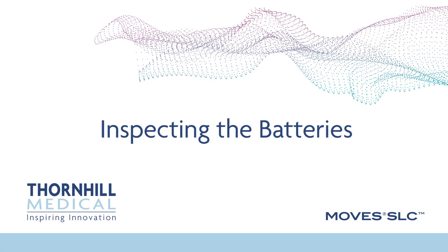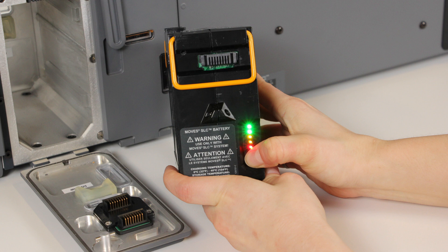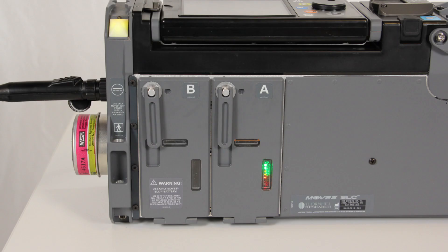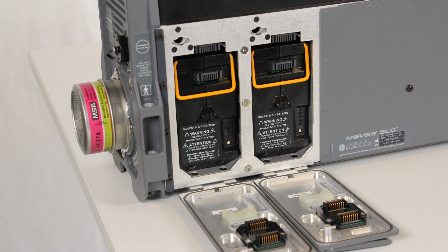Inspecting the batteries. On the front of each battery, just beneath the handle, there is a battery condition indicator. Pressing the button on the battery condition indicator shows the status of each battery. As the battery power decreases, the illuminated LEDs extinguish from green, meaning a high level of charge, through yellow, meaning a medium level of charge, to red, meaning the battery is exhausted. The power supply charger should charge both batteries to 100% in 2–2.5 hours while the system is running with a typical load. Note that the MOVES SLC must be operated with at least two batteries or one battery and connection to the power supply.